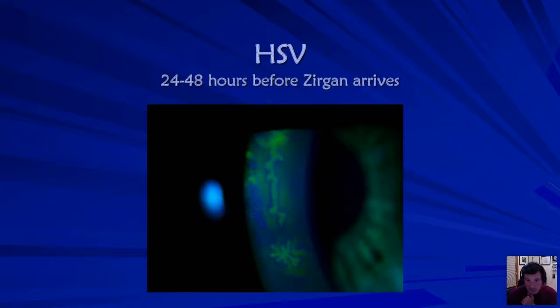And studies have shown that it might be just as good as going topical. My rule of thumb is when it's centrally located, I'd like to go topical. If it's out in the periphery, I'm okay to go orals. But if I can't get the topicals, a lot of times I'll place a Prokera or an amniotic membrane on this to try and treat this. And you'll see why, in a few slides, I said Prokera.